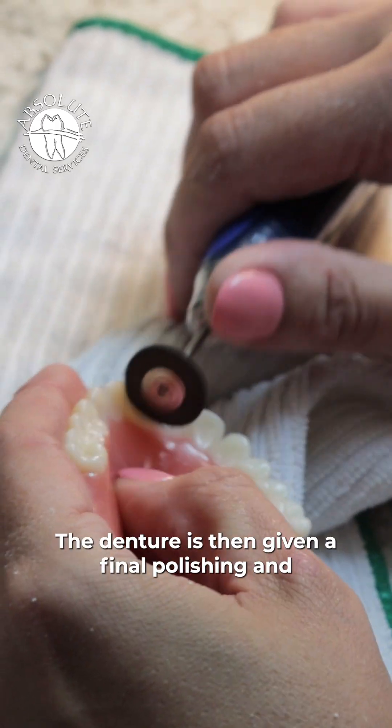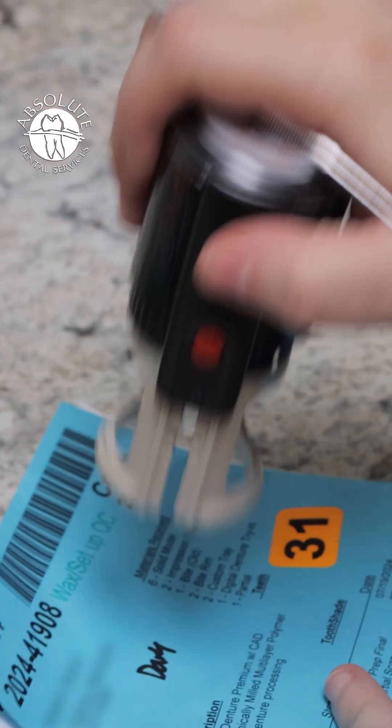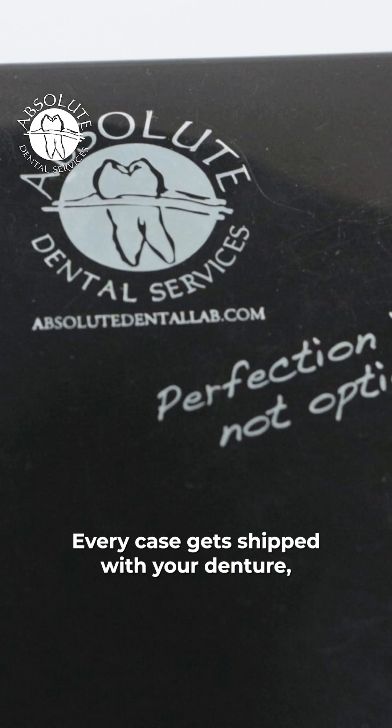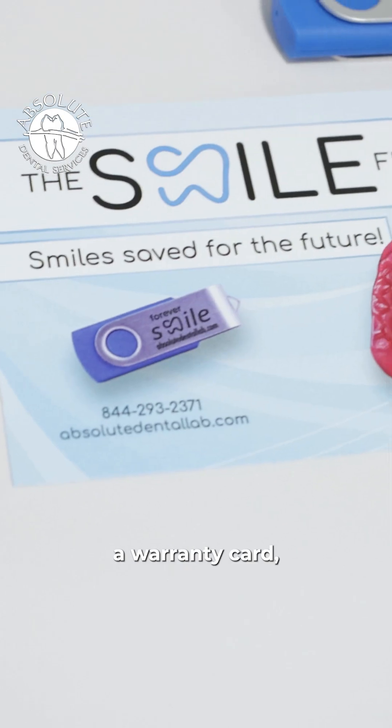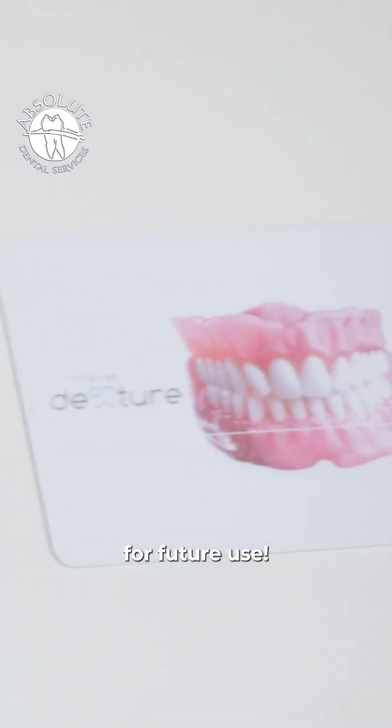The denture is then given a final polishing and quality check before being prepared for shipment. Every case gets shipped with your denture, a warranty card, and a USB with your archived smile for future use.